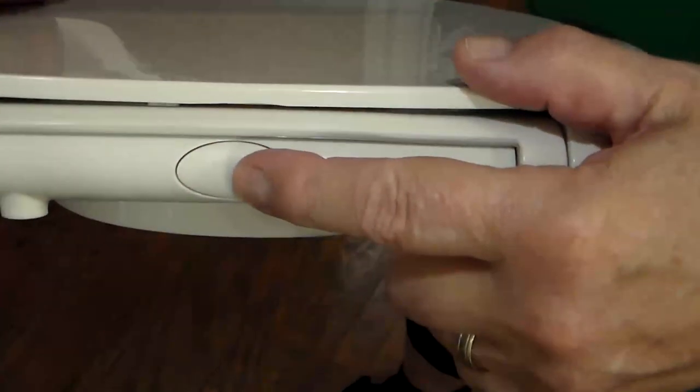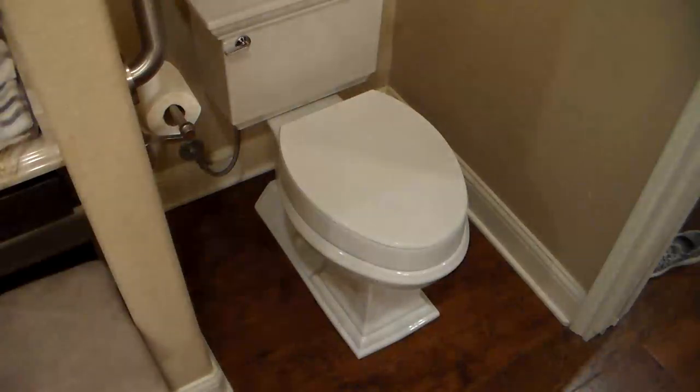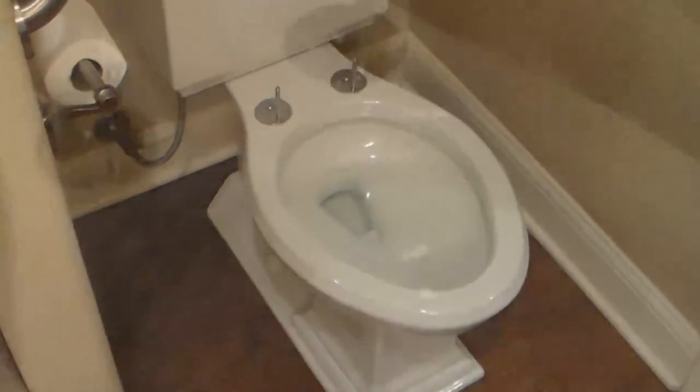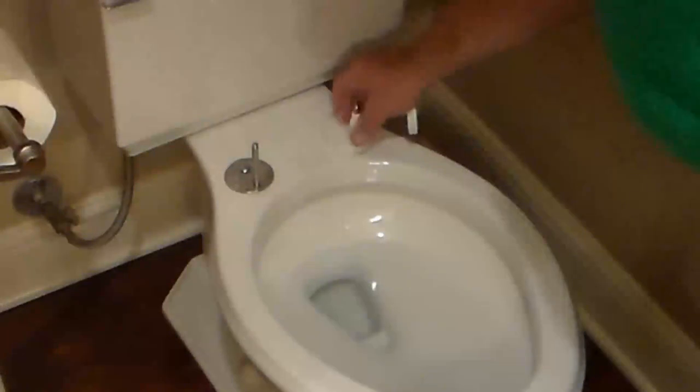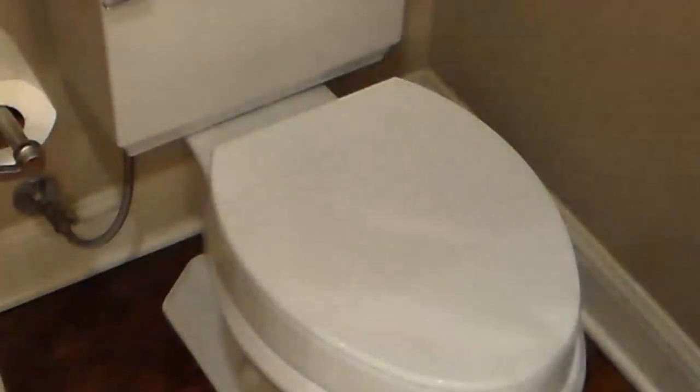This is the button I'm talking about — you can just press it with one finger and then lift the toilet seat up. Once you have the seat positioned the way you want it, go ahead and tighten it down with the seat installed. Once you get the seat positioned where you want it, press the button and it releases. Then get your little covers, put them on there, and it's installed.